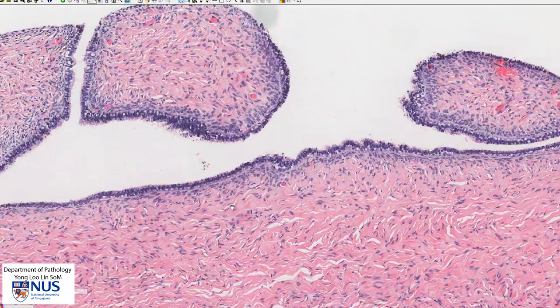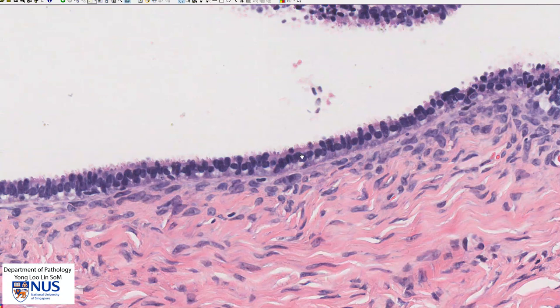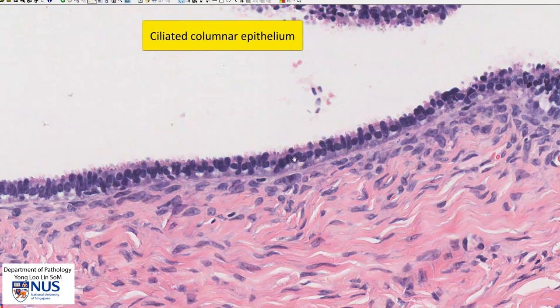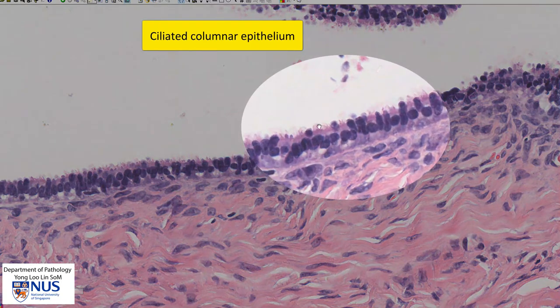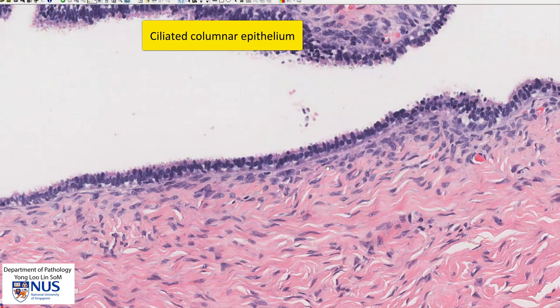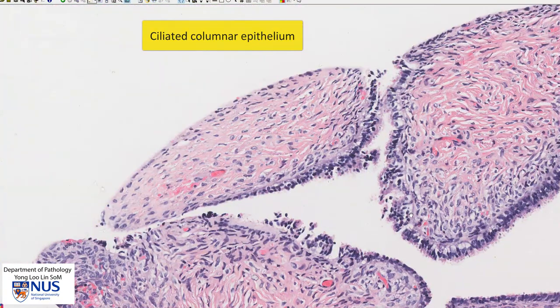Let's take a closer look at the lining epithelium. We can see that these are columnar cells. The nuclei are relatively basely located. At the surface of these cells we can see cilia — these look like little hairs arising on the surface and they are similar to the cilia that we see in the respiratory tract. This epithelium closely resembles epithelium of the fallopian tube.